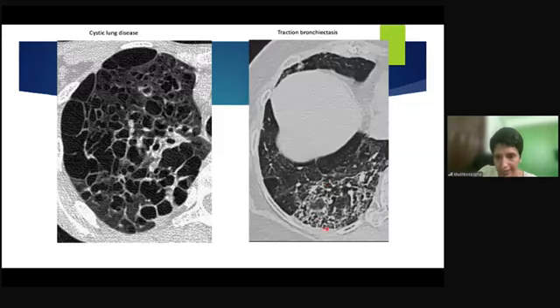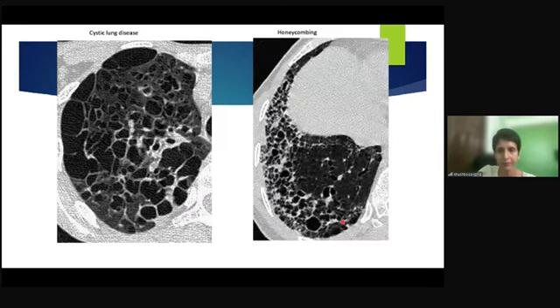Then you look at these, again, tiny cystic areas. This is traction bronchiectasis because they're communicating with each other, and you see the distortion of the surrounding lung parenchyma causing traction dilation of these bronchi. Honeycomb cysts, so these are cysts, but not of the cystic lung disease. Why are these honeycomb cysts? They are all sharing walls with each other.